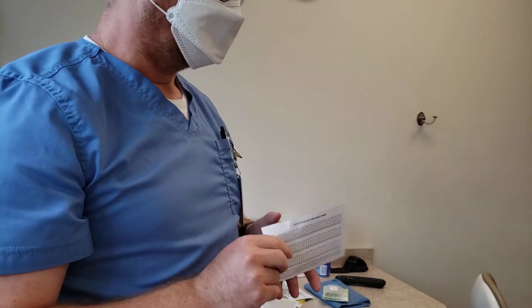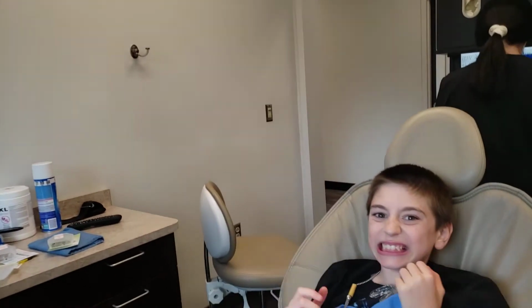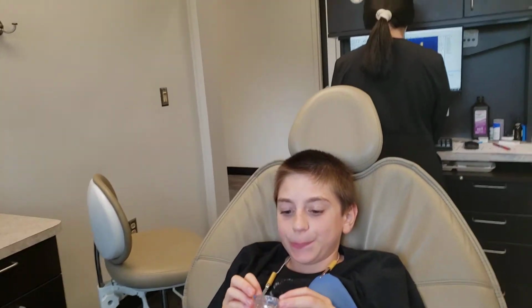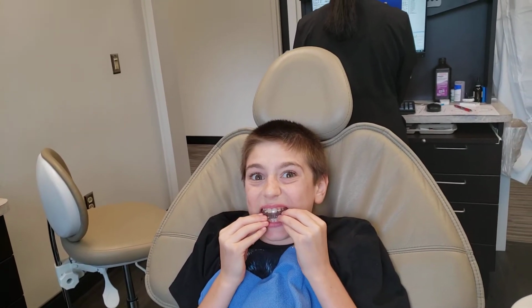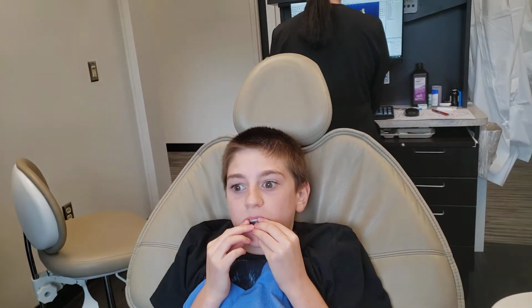Hey, bud, so let's see if we can put your teeth trainer back in. Go ahead and put it back in. You got it. And I want to see if you can keep it in for 10 minutes, okay? I will give you 4 Minecraft points.